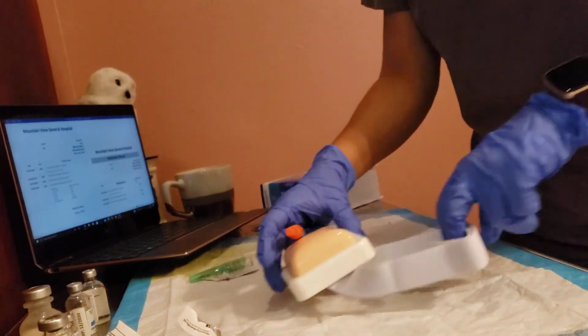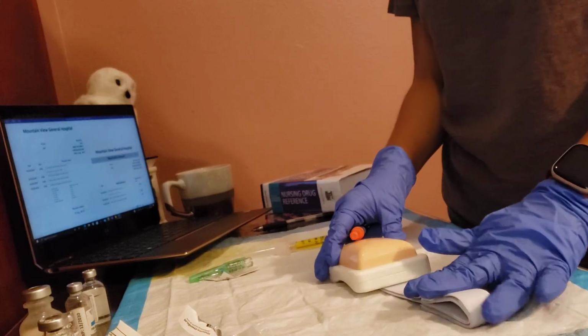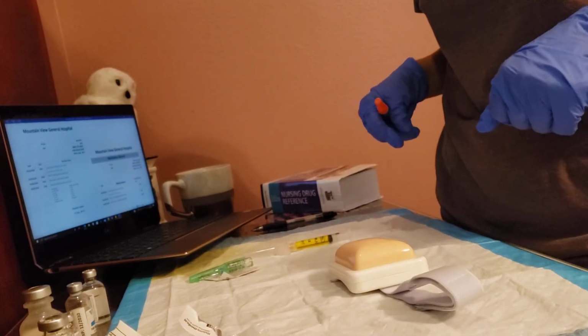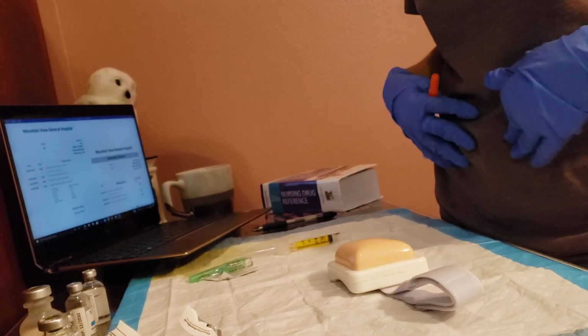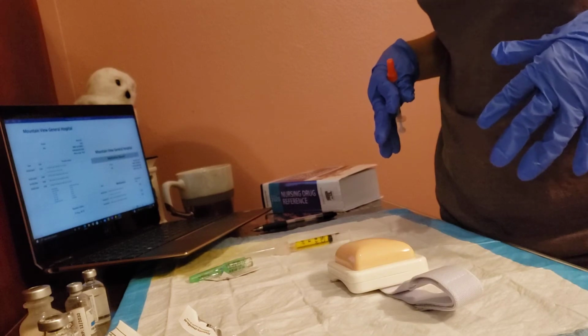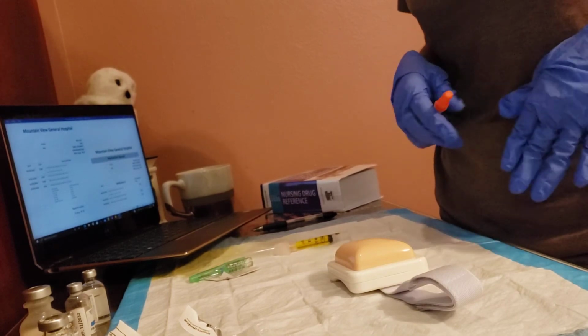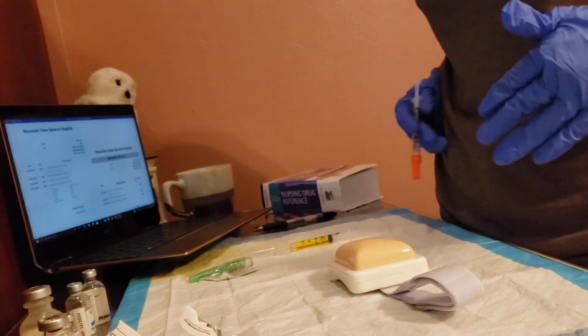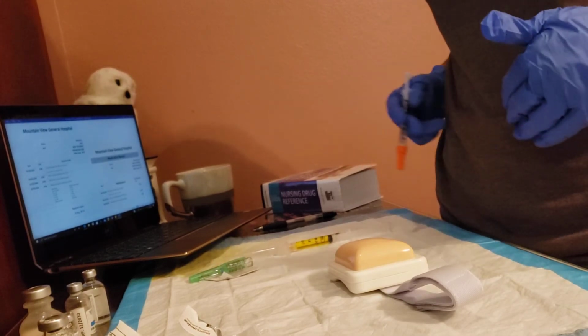And so I'm going to want to do it in his belly area, and I'm gonna look at his skin and make sure that there's no type of breakdown or redness. I want the skin that I'm gonna go on to be good skin. And I'm gonna go on the opposite side that he went on prior.